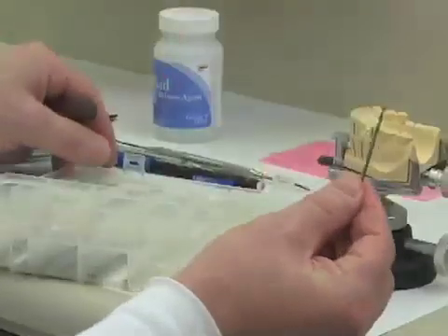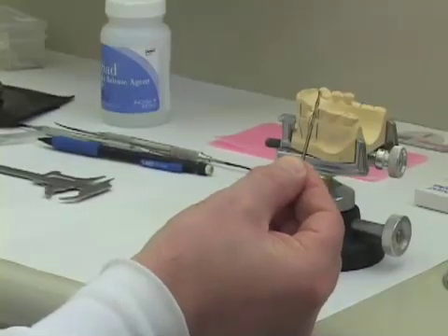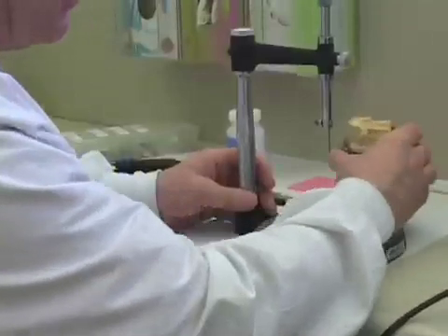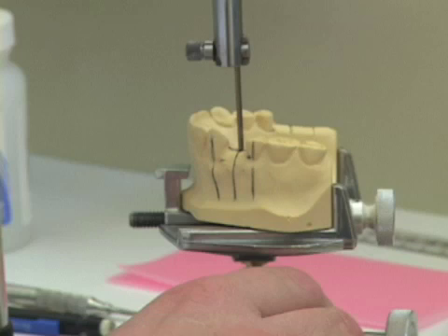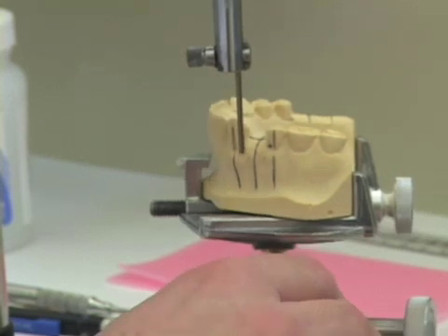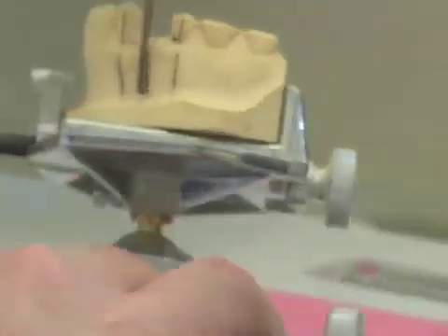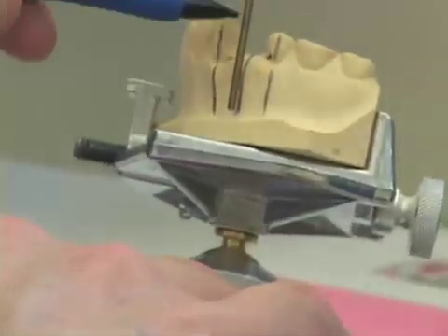One of the first things I'll do is take the 2 millimeter drill itself from this kit. This drill can be placed in a dental surveyor, very much like a dental surveyor tool. Bringing in the cast, I discussed the location of the implant. To determine the orientation, I simply hold the drill blank down in front of the buccal aspect of the cast and see whether my drill, placed in the surveyor as though it were a surveyor tool, lines up on my reference lines.